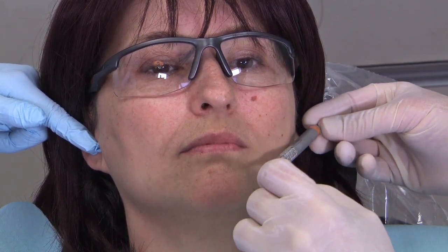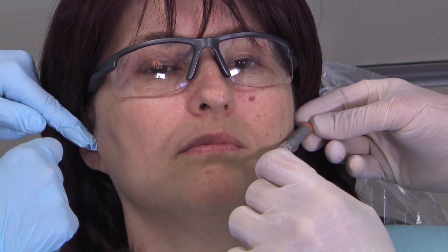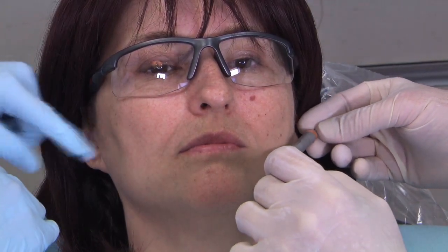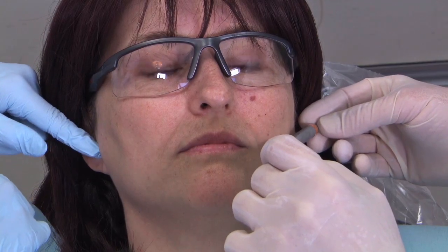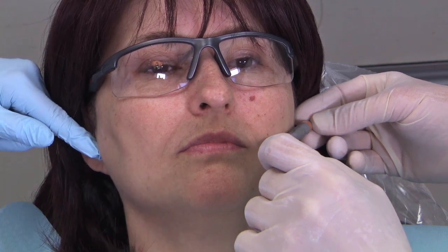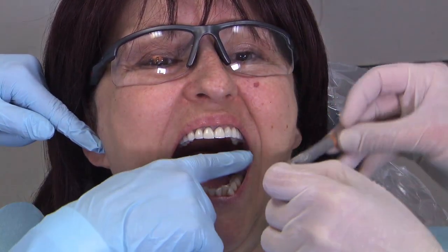Is this different on everybody — are there people where it's markedly different? They're generally going to have a subtle inclination, but this will be specific to her because we're trying to orient to work with the condyle. And this is done with her mouth closed to start with, then have her open wide and see how much it changes. It doesn't change much at all, because you're still going to her commissure.